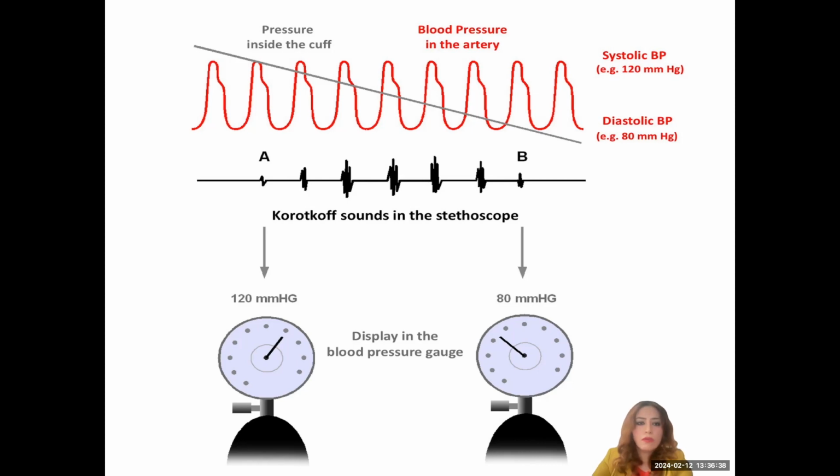Okay, that's all for today's course. As I said, if you watch the videos I added to this presentation, you can understand better. Also for the Korotkoff sounds, you can find really detailed videos that explain the stages to you. But these are the most important parts, the things that I told you, the summary of these processes for the blood pressure measurement systems.